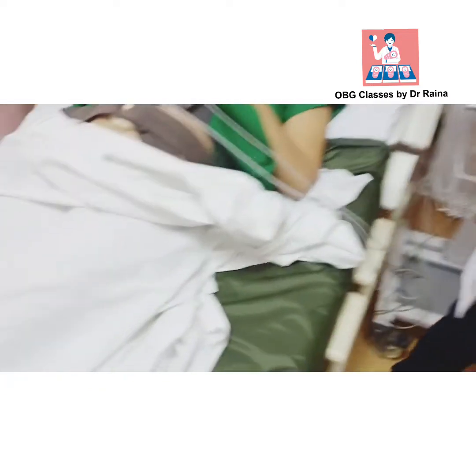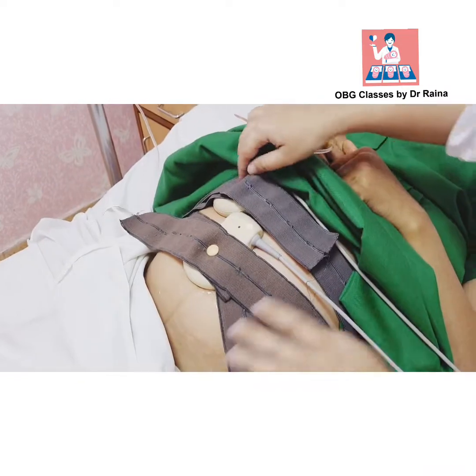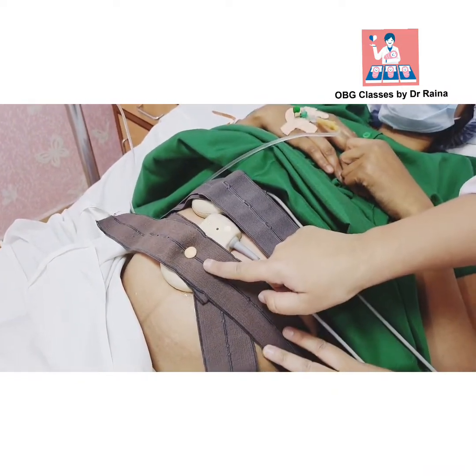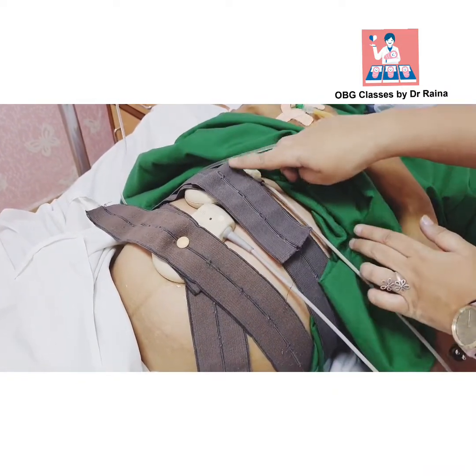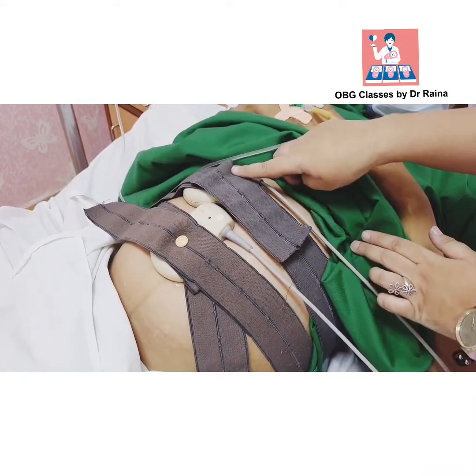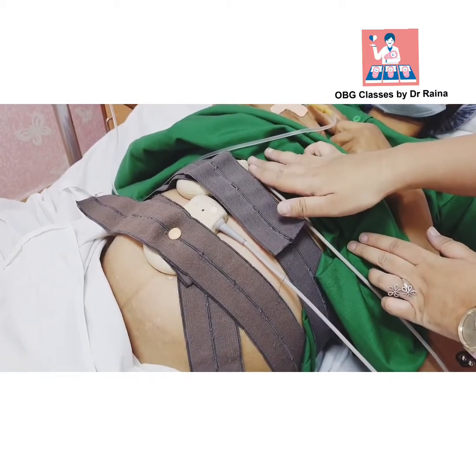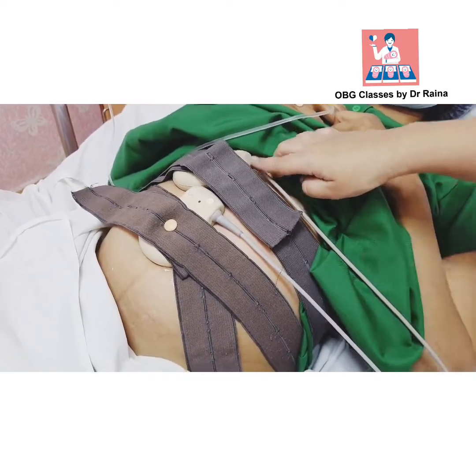Here we have a CTG. You can see there are two probes. This is the cardiac probe which measures the fetal heart rate, and this is the toco probe which is kept at the fundus of the uterus and measures the uterine pressure.